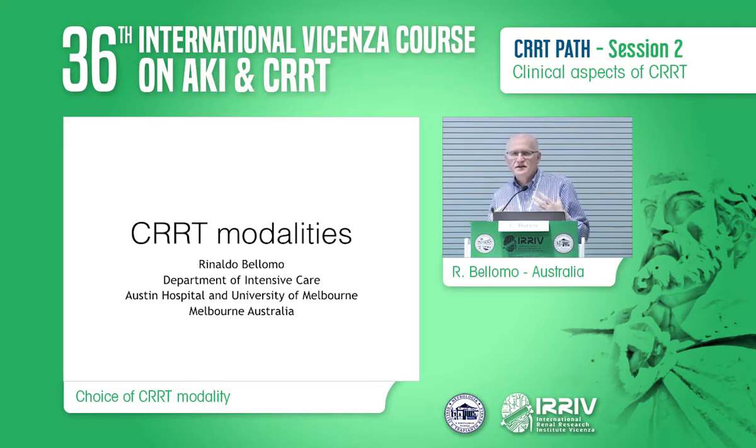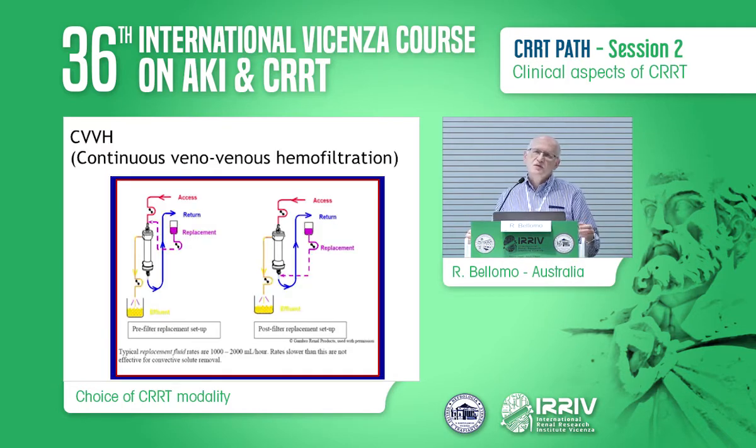So you've had the presentation from Claudio, which is an important setup into the technology and the characteristics of CRRT. And the next question is, if you choose to use CRRT and you've made that commitment, there are a variety of modalities of CRRT that you need to consider, and it's important to understand the principles of all of them and to understand the evidence that's available in order to guide your choice of CRRT modality.